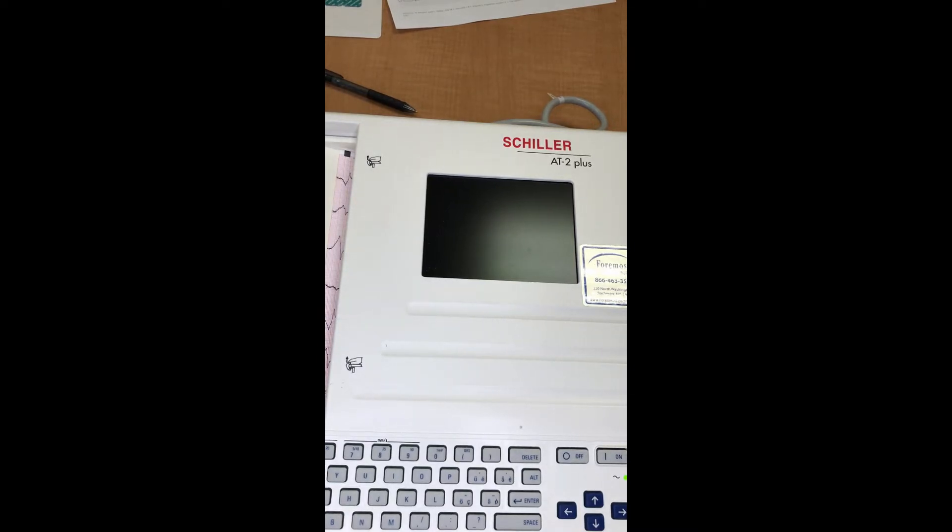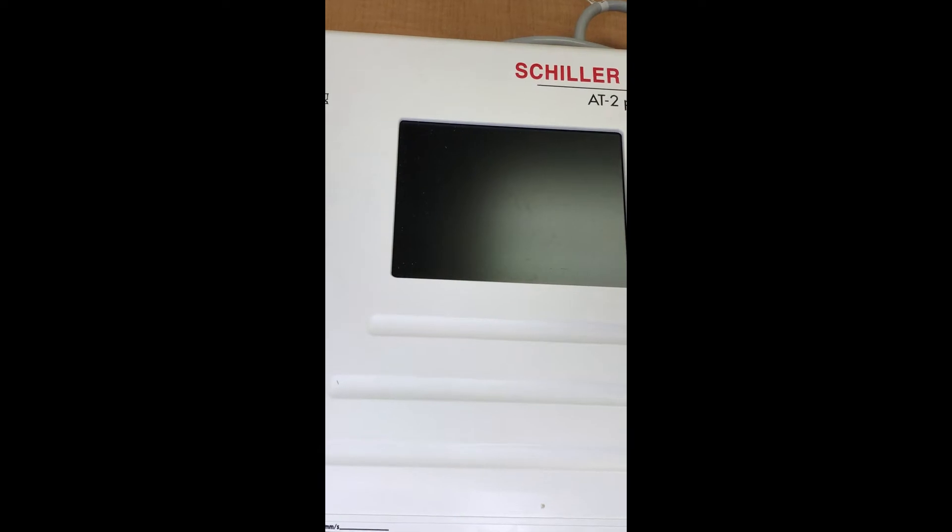All right, welcome back. Let's take a look today at an ECG and more particularly a normal one and what it should look like. You can see the little ECG machine sitting in front of you right here. I'll zoom in just a little bit so maybe you can see a little bit better and we'll take a look at what we have on it.